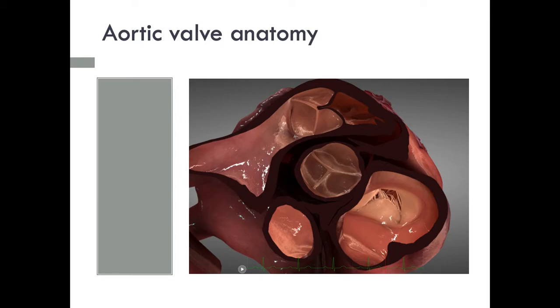The tri-leaflet valve again, anterior is uppermost in this image, and that is the right coronary cusp, the most anterior of them, and the left and the non-coronary cusp, which is related to the atrial septum between the left and right atria.